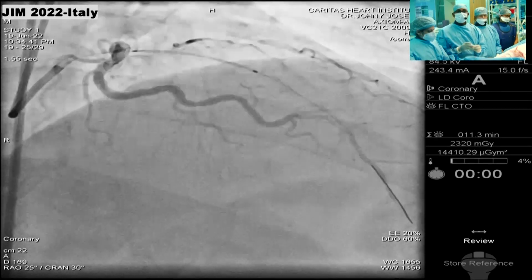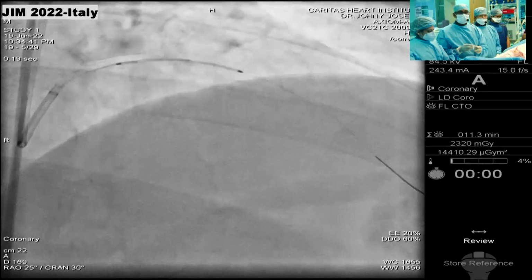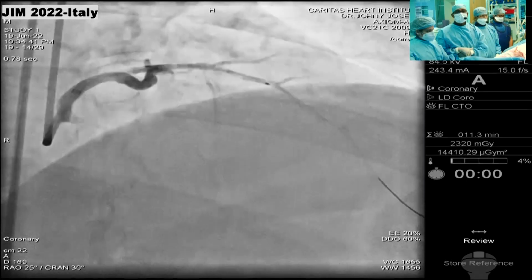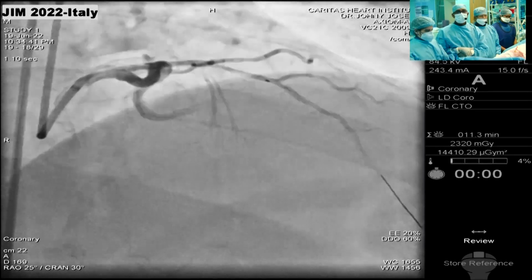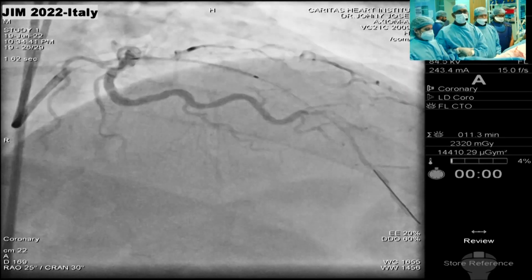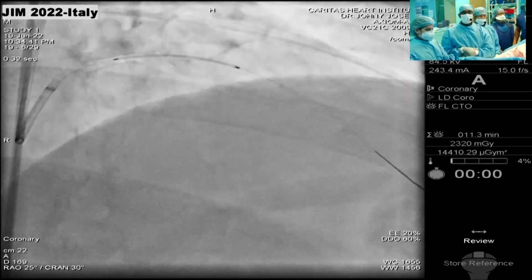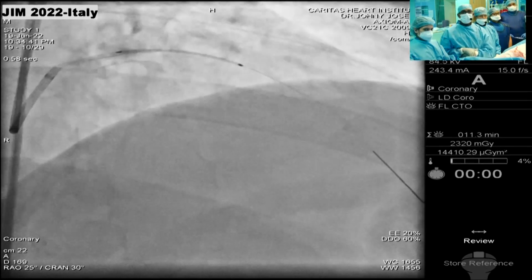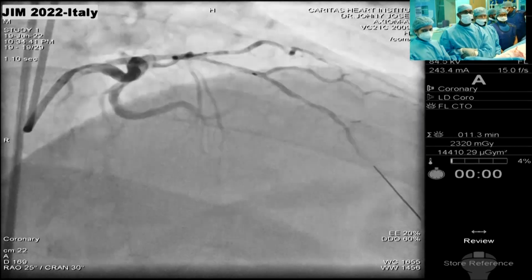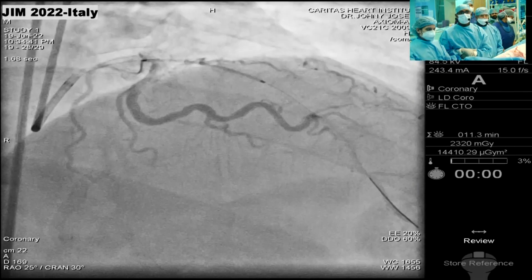I had the impression the size at the occlusion was a little underestimated; the vessel is probably 3.5, at least in that elliptical area in one of the two measurements of media-to-media diameter. Still, I think the choice of being a bit undersized with the stent to start distal and use a larger one going from the proximal leading to the left main is very wise, and I've seen a wire protecting the circ, which is definitely the most important vessel.